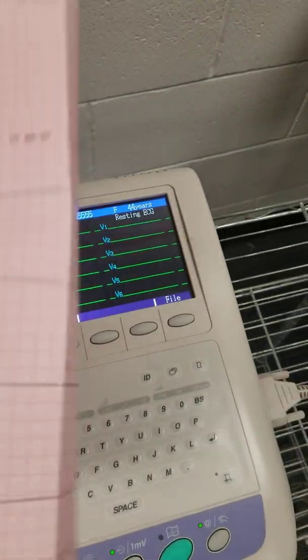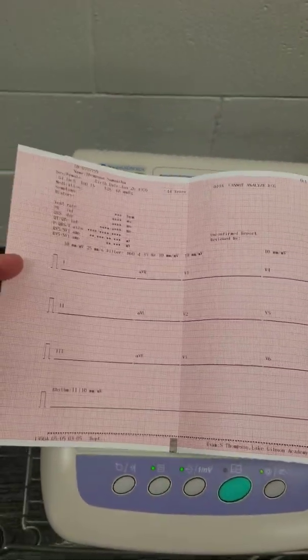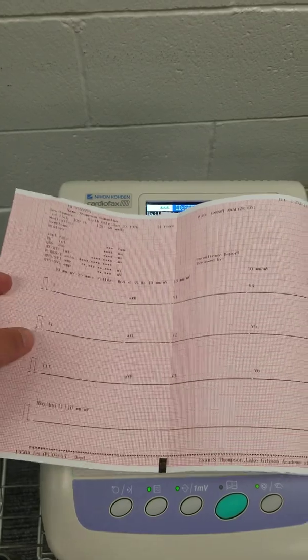It'll give you a doorbell sound to tell you that it's there. And then it's going to print out a two-sheet. Mine is a little large because I had it off kilter — it will look more like this one when it's done regularly.